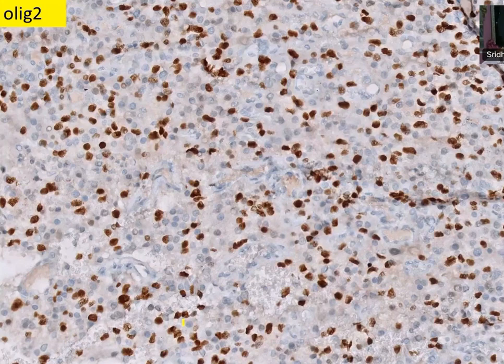Because there is an entity called diffuse hemispheric glioma, histone G34 mutant, where they can have ATRX loss, but it will be OLIG2 negative. So here OLIG2 is positive, which tells you that it is not a histone mutant type. In this kind of scenario, you should advise gene sequencing. Okay, that's what it is.